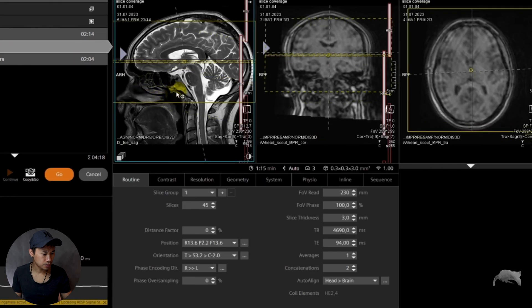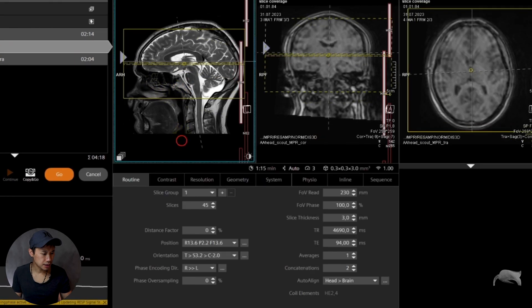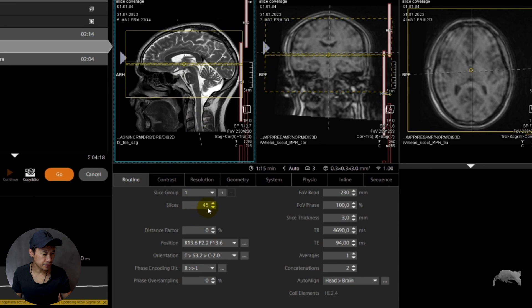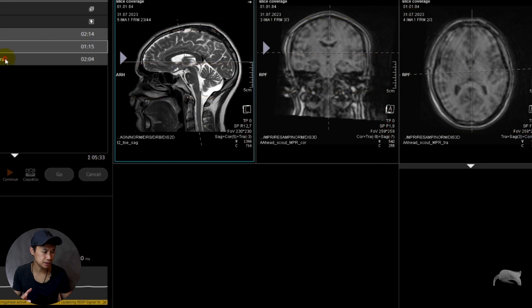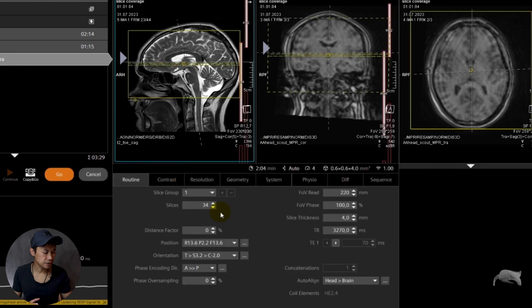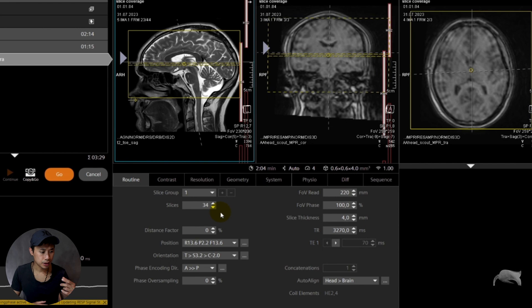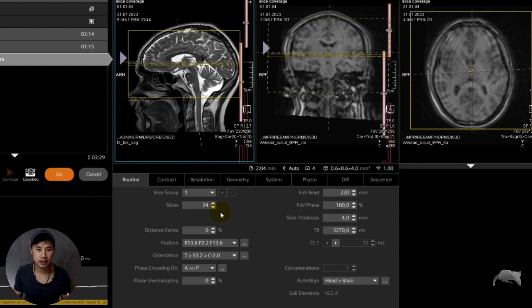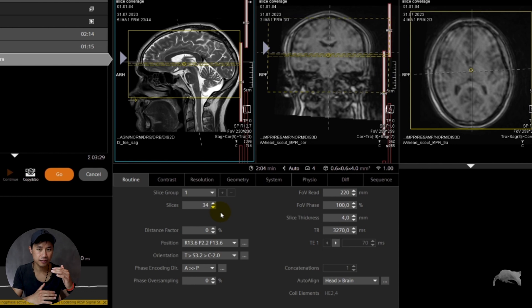Let's open this T2. You can see this T2 has 45 slices and it's 3 millimeter slice thickness. Let's go for the next one — this diffusion I did on purpose just to show you it has 34 slices but 4 millimeter, and nonetheless it covers the same anatomy from the top to the bottom.